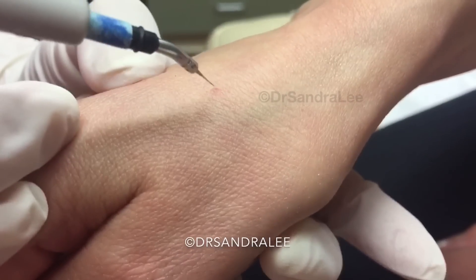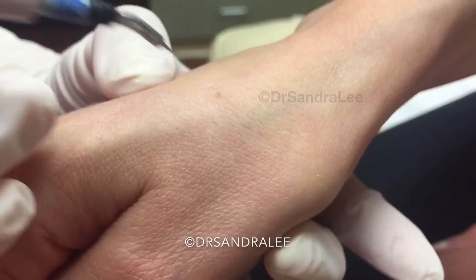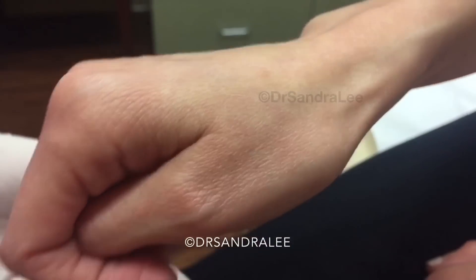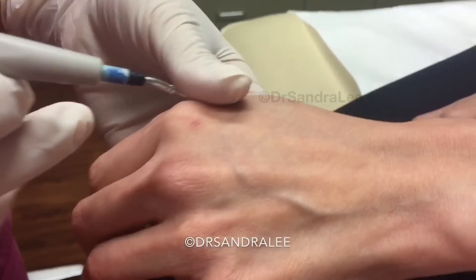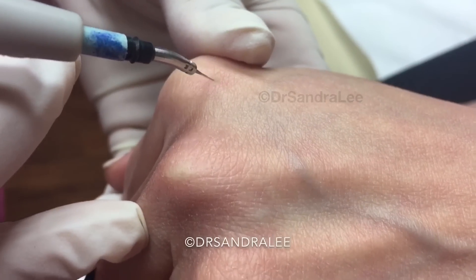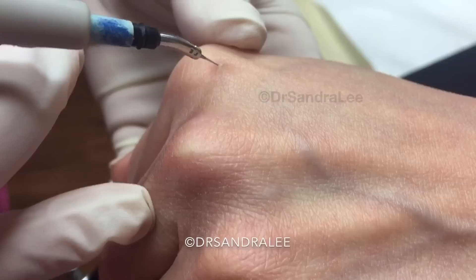You ready? Just a little baby pinch — okay, there we go. Looks better already, nice. And this one too. You can hold your hand a little closer, it'll help. This one might be a little harder because of where it is — it's a little pinch.